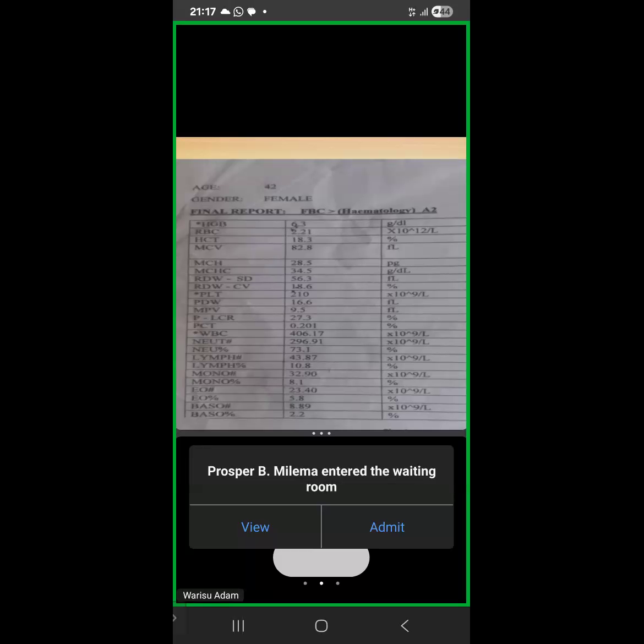And then what else? What about WBC and platelets? I thought we already spoke about the WBC. You are commenting, so your commenting should be holistic. For platelets, they are normal, but the WBC is very high, so I expect to see many of them on the film.